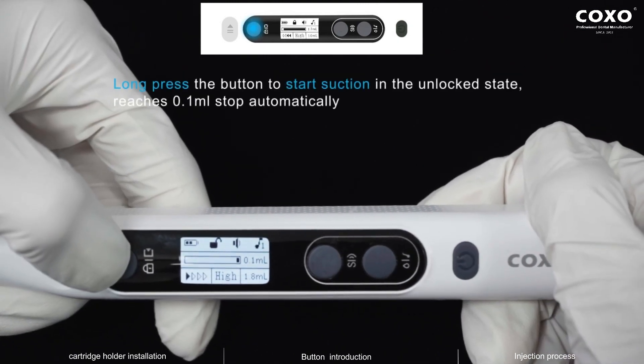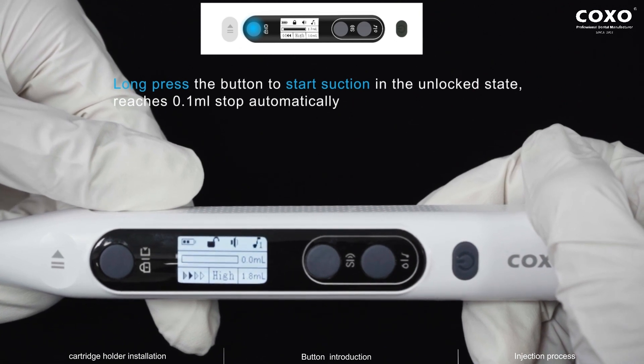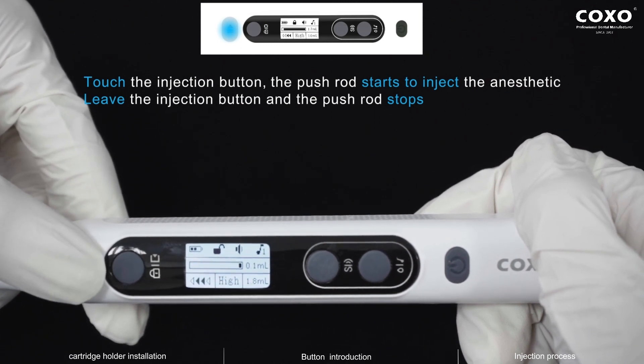Long press the button to start suction in the unlock state. It reaches 0.1 milliliter and stops automatically. Touch the injection button and the push rod starts to inject the anesthetic. Leave the injection button and the push rod stops.